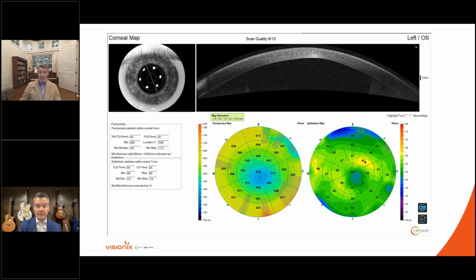Okay. But if you go to the little laser somewhere, there's a small, tiny little asterisk on the bottom left scan. And that small, tiny little blue star asterisk denotes the thinnest part of the cornea. And it actually shows you over here on the left-hand side of the screen what that minimum thickness reading physically is.